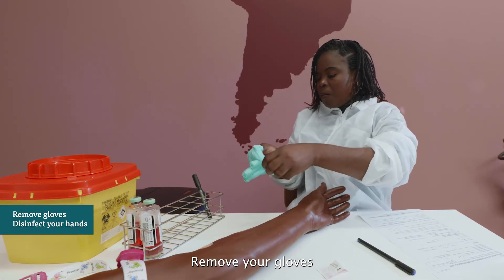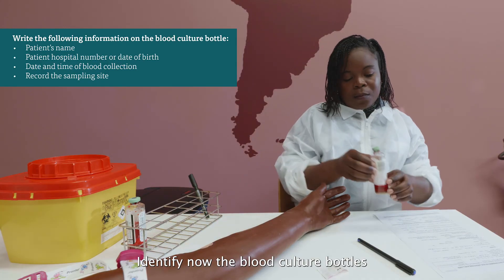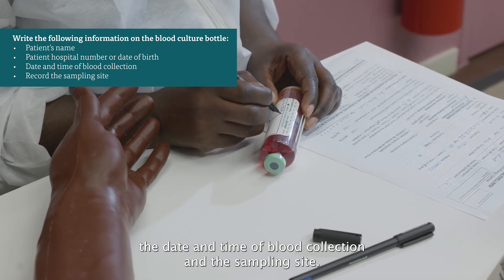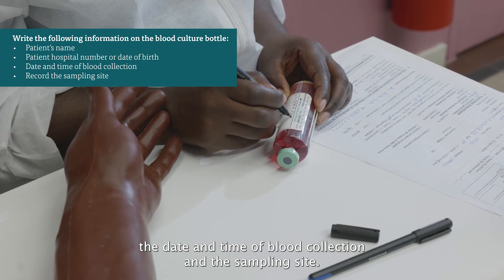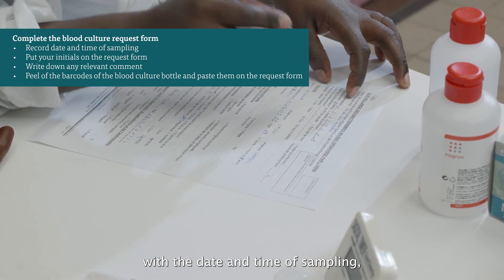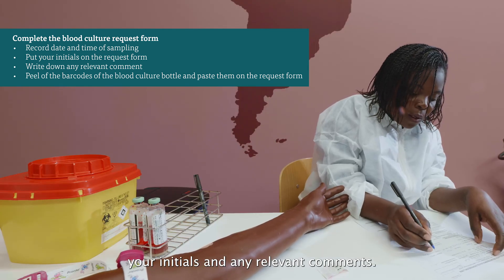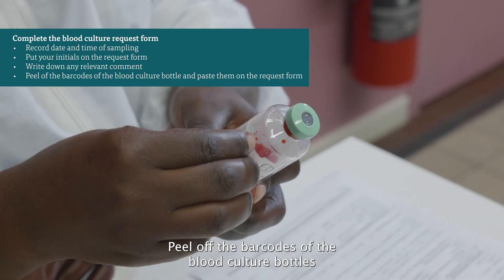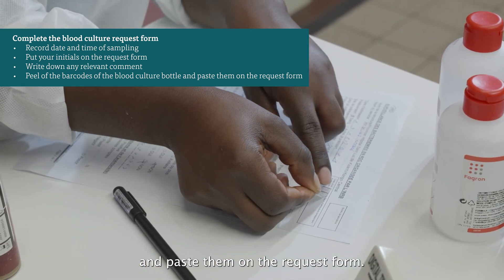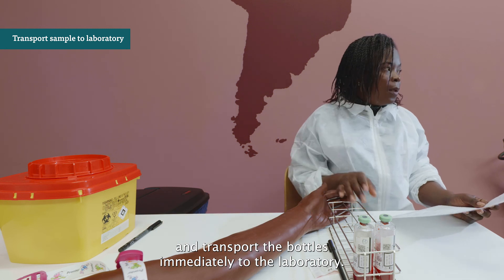Remove your gloves and disinfect your hands with alcohol-based hand rub. Identify the blood culture bottles with the patient's name, hospital number, date and time of collection, and sampling site. Complete the blood culture request form with the date and time of sampling, the type of bottles, your initials, and any relevant comments. Peel off the barcodes from the blood culture bottles and paste them on the request form.